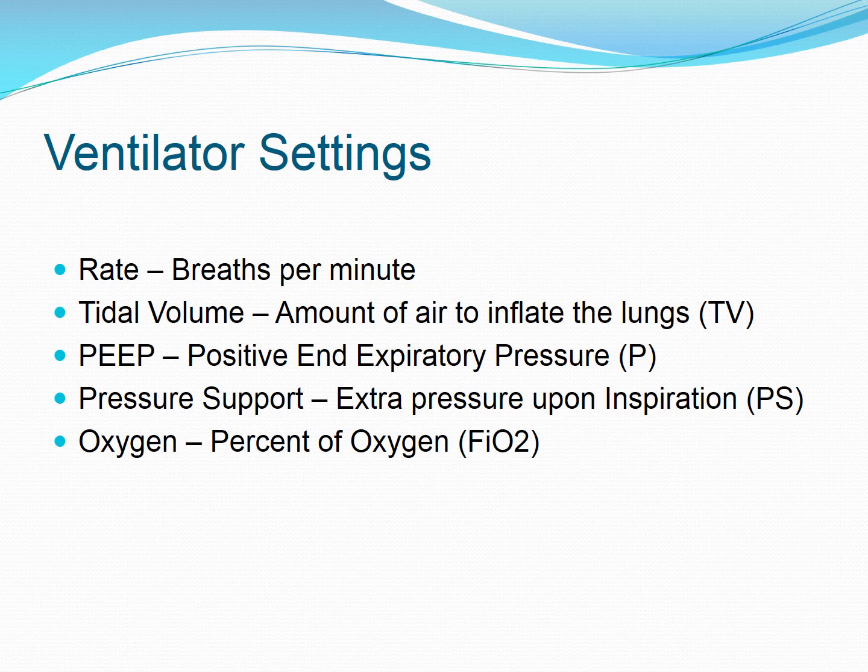PEEP is positive end expiratory pressure. So this is the pressure at the end of expiration to try to keep those alveoli open. They call that recruitment. So you're recruiting the alveoli. A normal PEEP for you and I is 5. So what happens is the higher the PEEP, the more difficulty we're having oxygenating the patient.